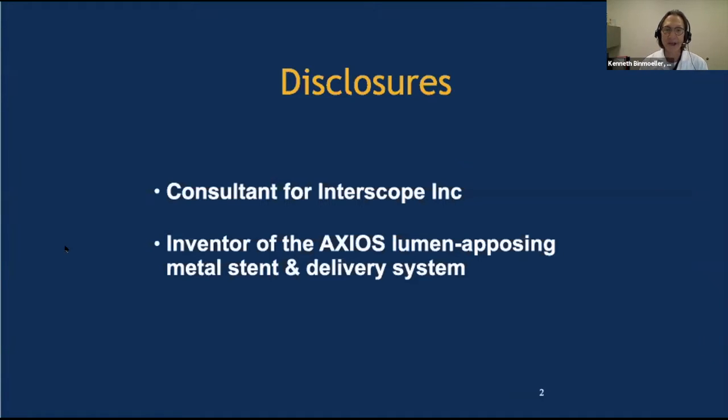I'm also the inventor of the AXIOS lumen-apposing metal stent and delivery system. Now, the two are really interlinked because AXIOS, I developed it as a port to enable us to access the extraintestinal space more safely and more reliably and predictably, with outcomes that we can justify dissemination with.